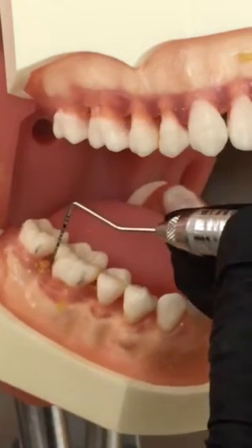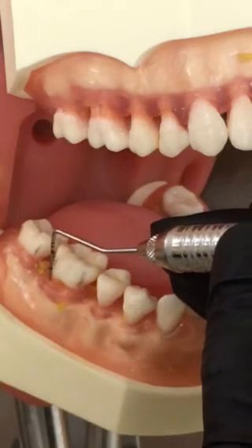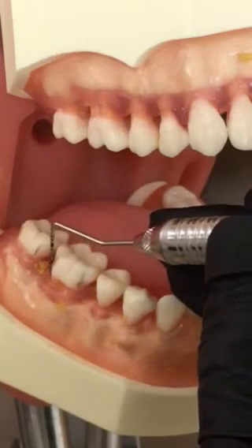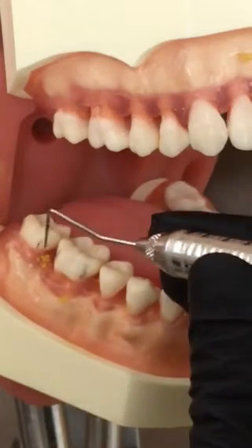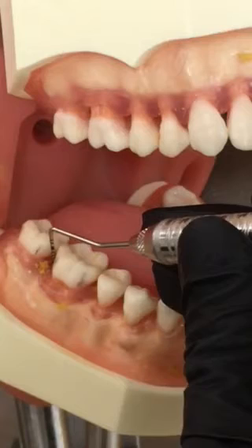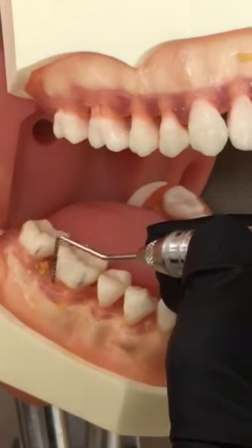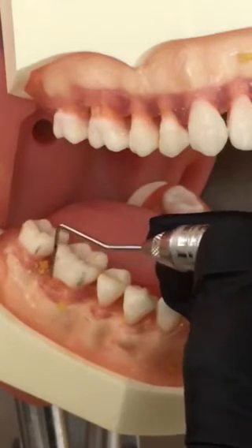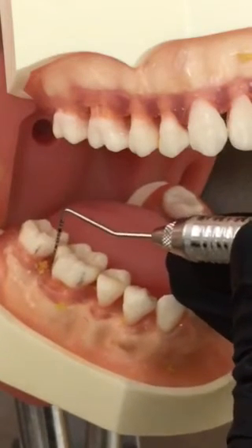There are a couple of ways to do this. In the textbook, it shows that you enter at the distal line angle, probe to the epithelial attachment, and work your way back distal, angling into the col. Or you can start in the col area and then gently walk the probe around the sulcus. Notice I'm not taking the probe in and out repeatedly — you want to stay subgingival to lessen the chance of traumatizing the tissue.